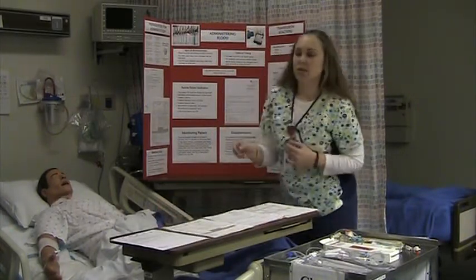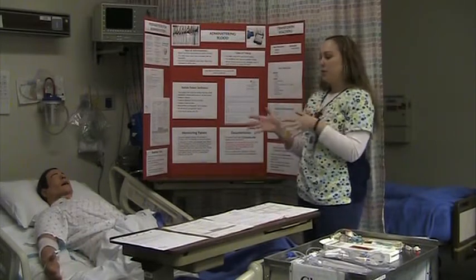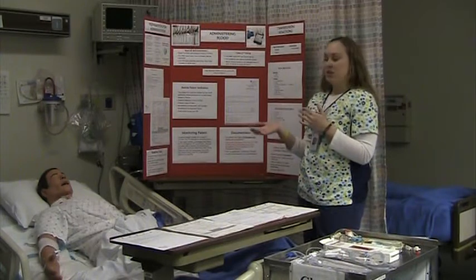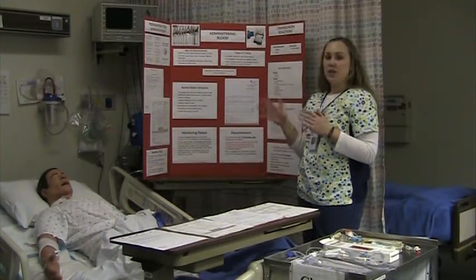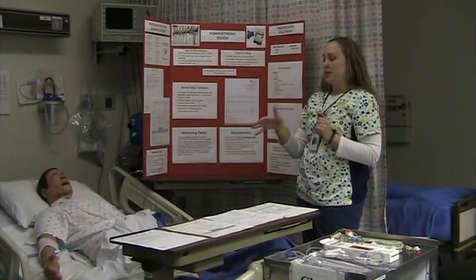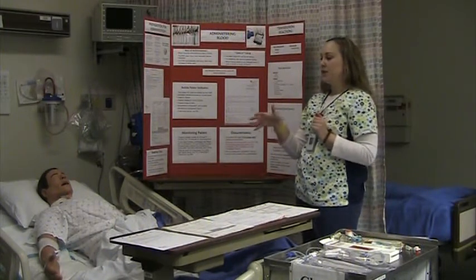So you set up everything in the room. You make sure that they have an 18 or 20 gauge IV and that it's good. You set up only normal saline that goes with blood. You set up the correct tubing. You get that all ready.